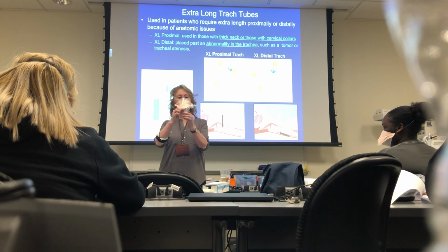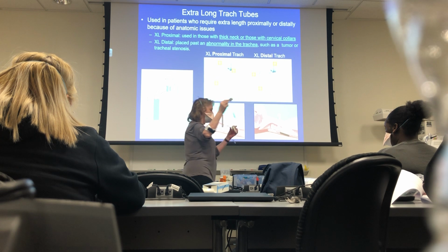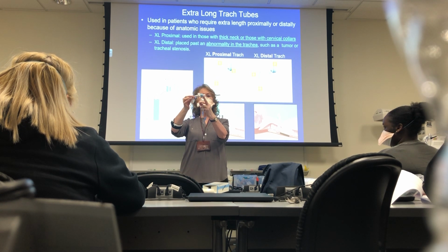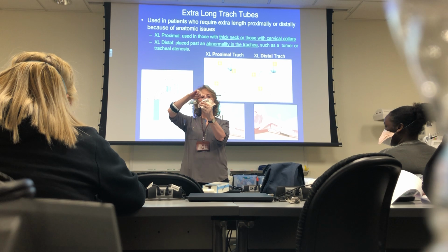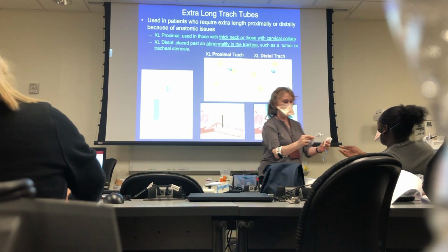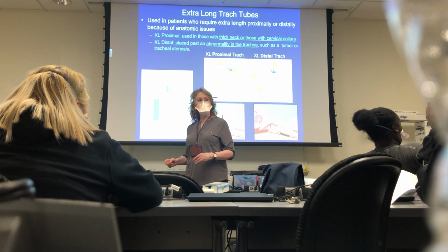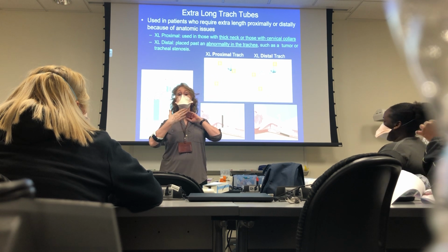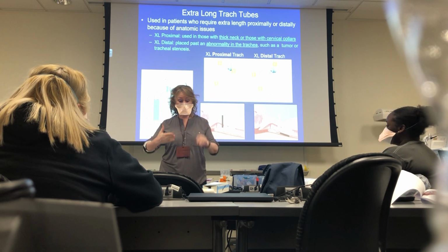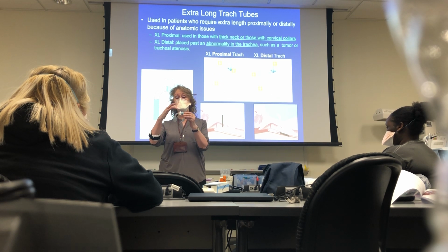So, you look at the elbow, okay? This is what a trach normally looks like. I know this is fenestrated. From here to here is longer. See how the elbow starts right here? From here to here is not that long. From here to here is longer. See the difference? To the elbow, here to here is long. Okay, so pass that around. That is an extra long proximal. So if there's a lot of adipose tissue and you have a leak with a regular trach tube, you need to suggest an extra long proximal tube. Okay, this is a distal. All right, extra long distal.